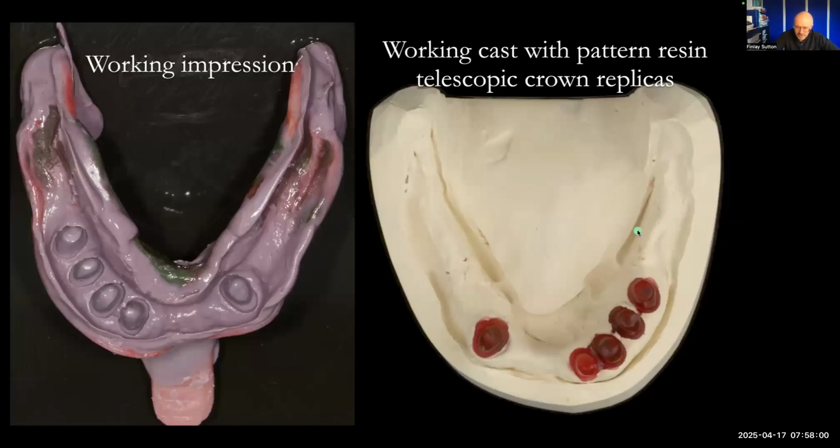I know, Bren, you've been in touch with me about this case, and you've asked me about altered cast technique. Now, I don't think we need to do altered cast with these. Altered cast is where we do an impression for the front section first to get the metalwork fitting nicely, and then for the free end saddles, there's a separate impression made. This, I think, takes this into account, and we can get some compression of the tissues with the green stick. And you can see I've got nice crown margins on those too.